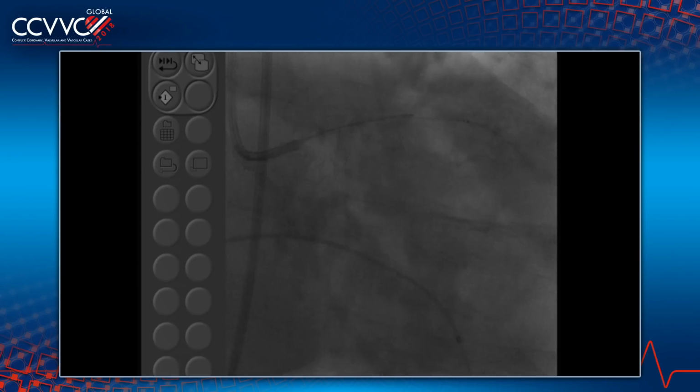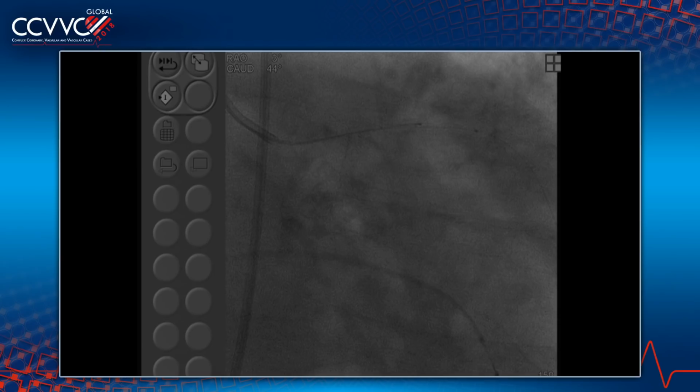Also, guys, I have to tell you a few things. Please put the IVUS on. Let me make a very important point from the cost point of view. TAVR has a lower contribution margin for the hospital because of the valve cost. If you add these additional devices at that time, the hospital is going to lose money on this very valuable procedure.